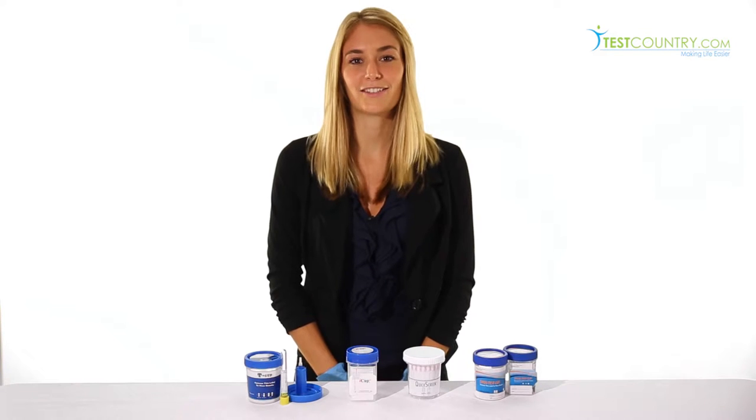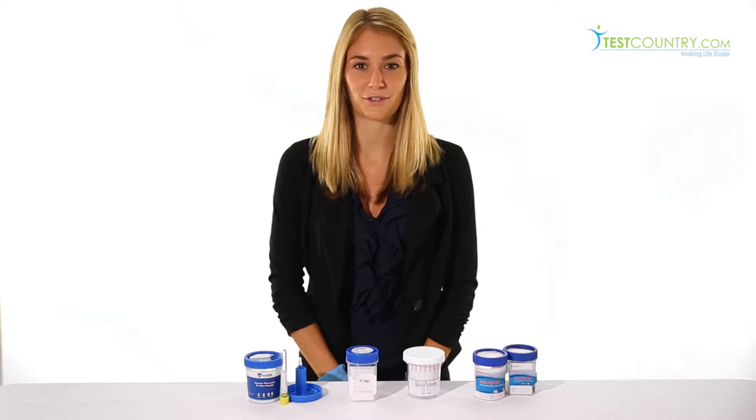Hi, my name is Sophia and in this video I'm going to show you how to use drug test cups.